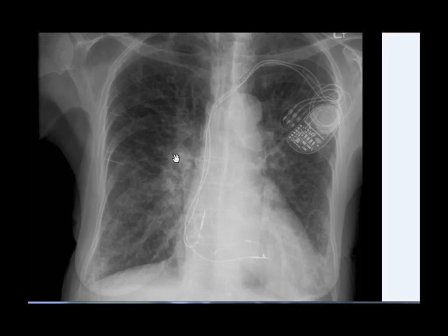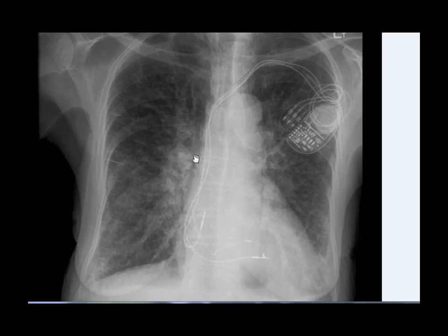The blood vessels in the hilar region are not clearly defined. On a normal chest X-ray you should be able to draw an outline of all the major vessels entering into the lung, which is clearly not possible in this case.